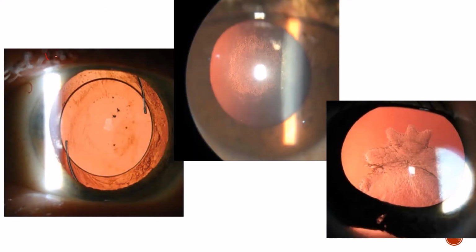Now in this first picture, just have a look. Here we have a rigid PMMA lens placed, and you can see that here behind the intraocular lens, you can see certain opacities, right? Like this, you can see certain disturbance in the red reflex. This is nothing but the posterior capsular opacities. Okay, so this is an early posterior capsular opacification starting.